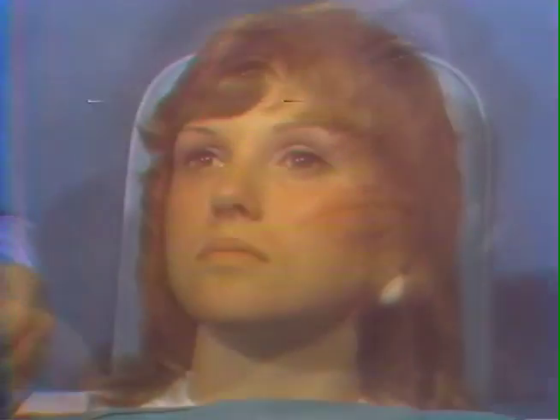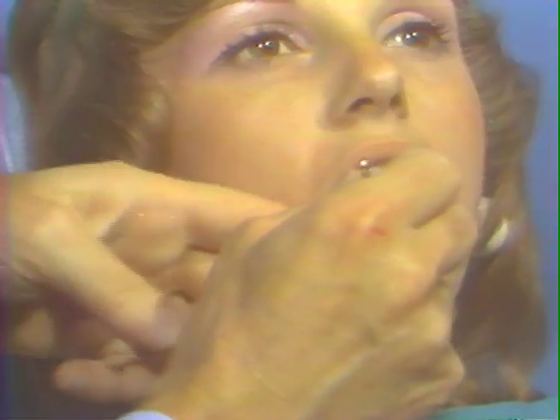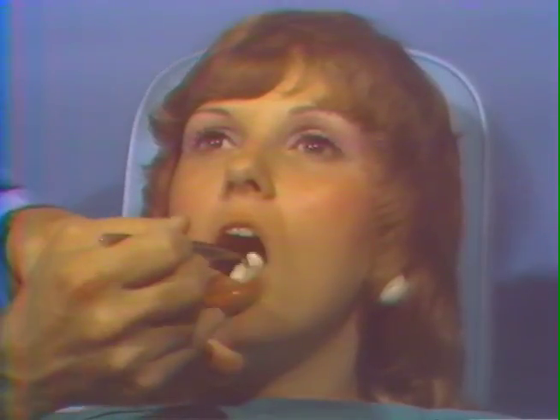At times it becomes necessary to anesthetize the lingual nerve in the anterior segment of the mouth, and topical analgesia may be produced for the anterior segment, right and left sides, by placing the cotton roll in this manner. Now open your mouth wide, pull your tongue, that's it, place this down. Now hold your mouth open like that. The cotton roll is held into the floor of the mouth against the mucosa. For the anterior portion of the lingual nerve left side, open your mouth. Hold it against the mucosa. Okay.